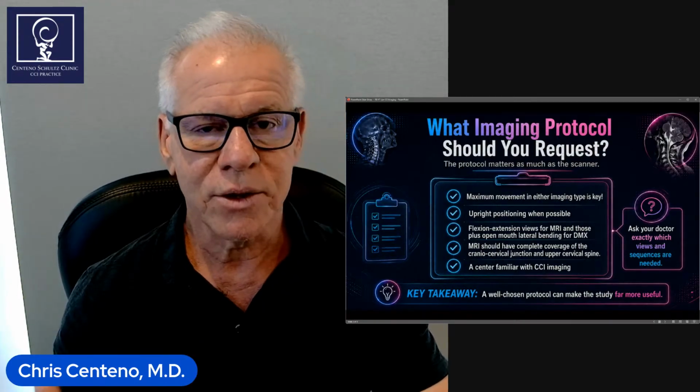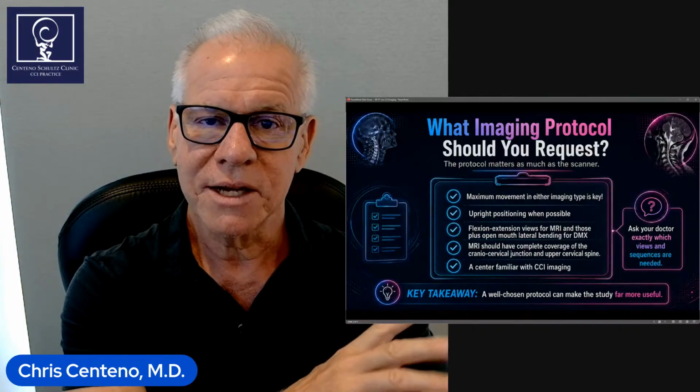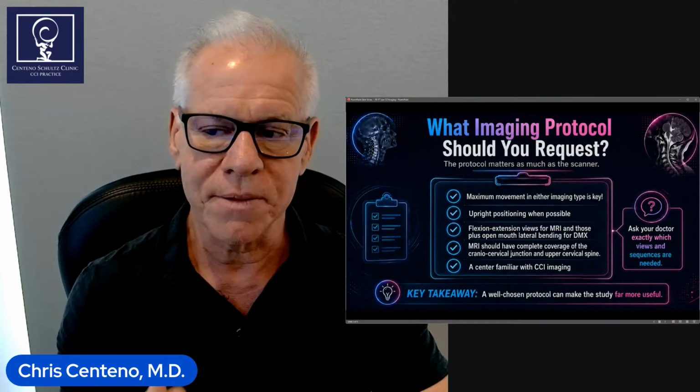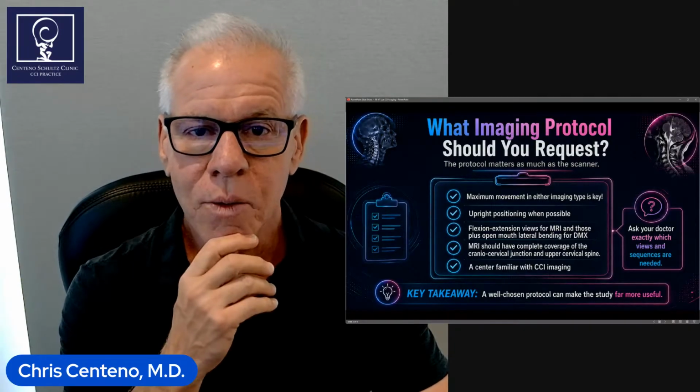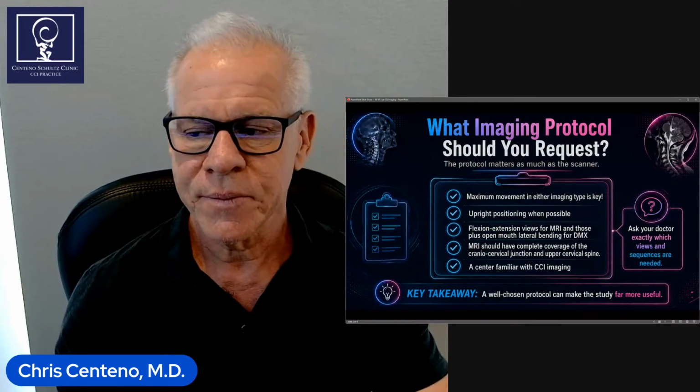in my experience, doesn't work as well simply because it's hard to push it to its limit because it takes a while to get the picture to form in an MRI. So it's hard to keep the patient in that position. Whereas if you're doing DMX, they're just over there for a second and then they come back.